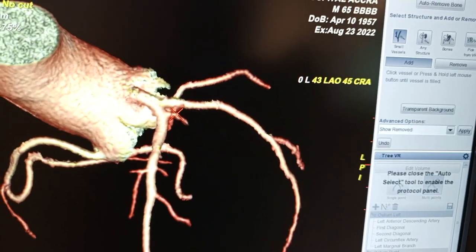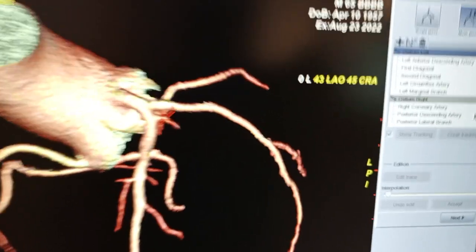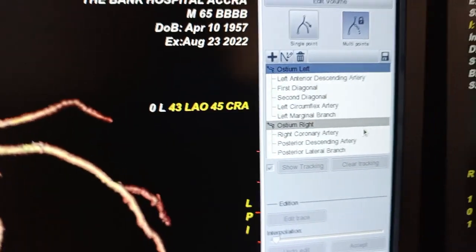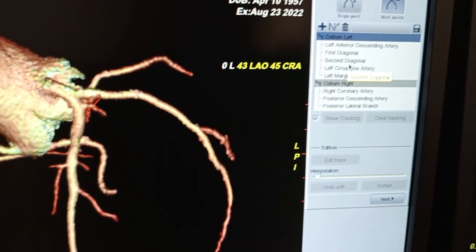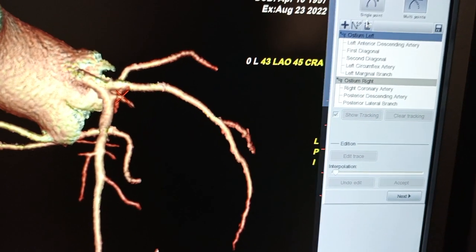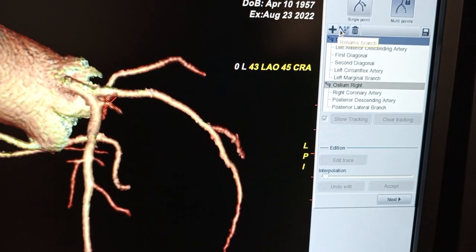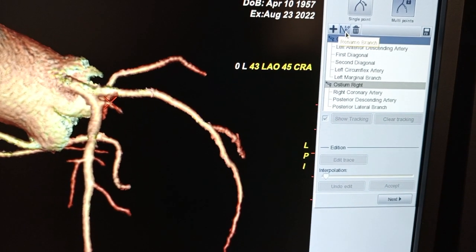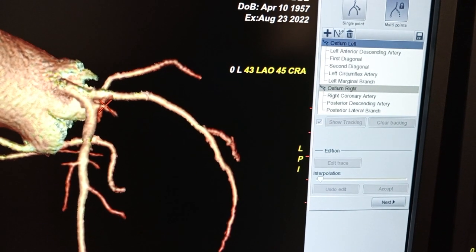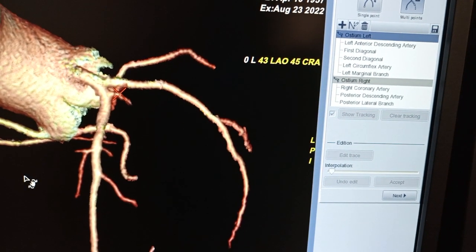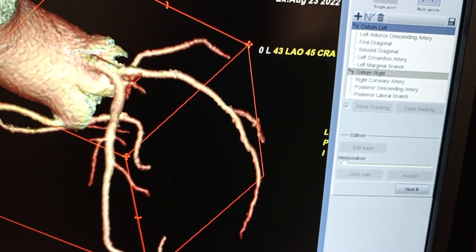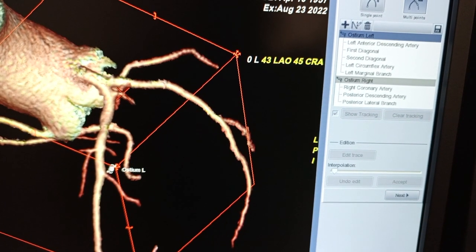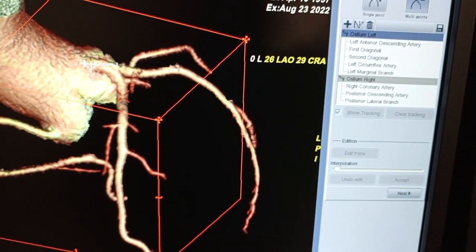Close the segmentation tool. These are the vessels — for any vessel that has not been accounted for, you can go to Add Branches. You can rename some of them and remove some of them. When everything is done, save the protocol. We are now listing the first — the left ostium.